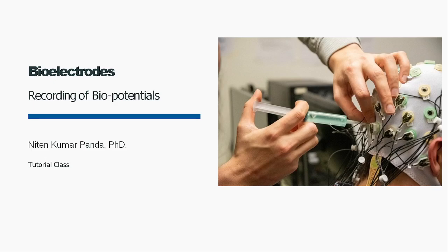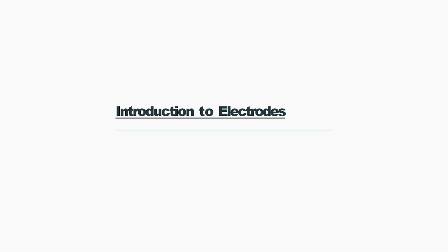Hello, today we will discuss bioelectrodes, or biopotential electrodes. We know that in a man-instrumentation system, we have to pick up the signals or action potentials that are generated at different organs, or we call those signals biopotentials. So, these biopotentials have to be captured. Before going to the different types of electrodes, we must know some of these terminologies, which will help us understand the functionality of different types of bioelectrodes, or simply electrodes.